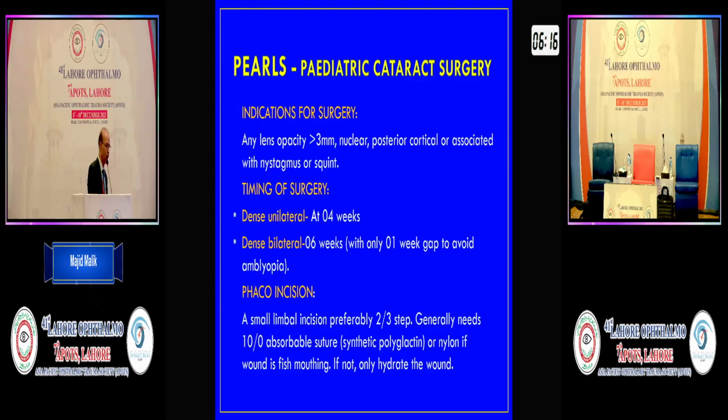Now, how to do it, and what type of phaco incision? Preferably a small limbal incision, in 2 or 3 steps, not a single step, as that will seal more safely. Generally it needs a 10-0 absorbable suture. If not available, then nylon is okay for the wound.